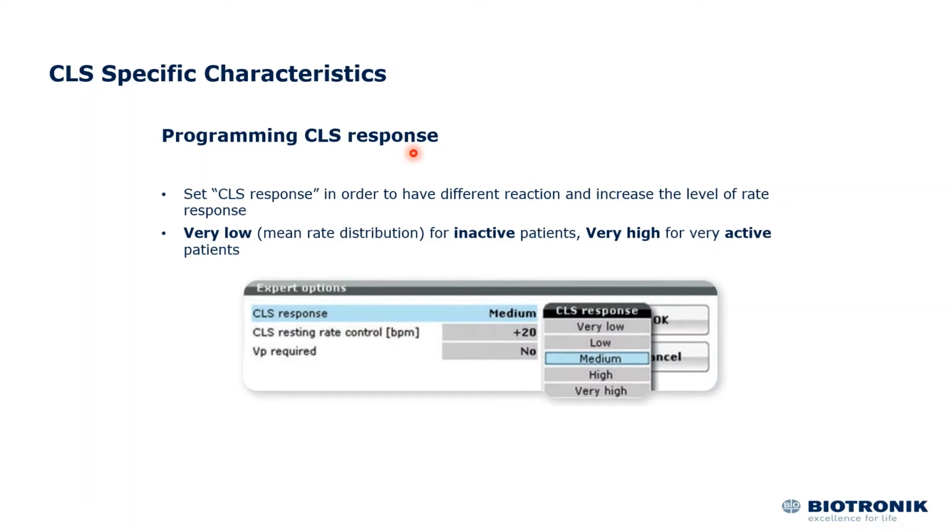So if someone is very anxious, someone who is overly OCD and things like that, you may want to dampen down the CLS response. So this interface allows you to change the response a bit based on your patient's needs and of course your patient's characteristics.